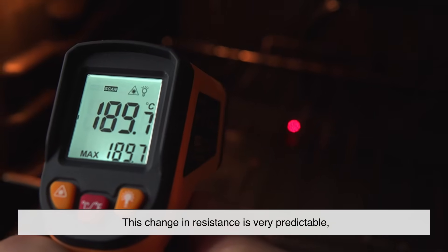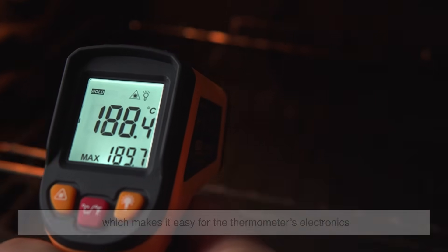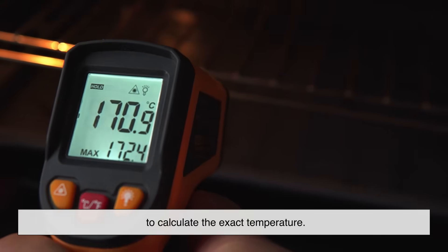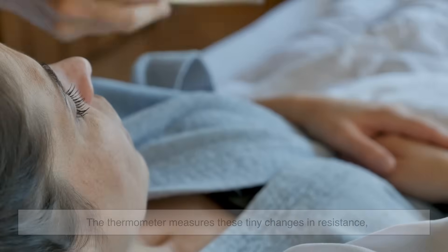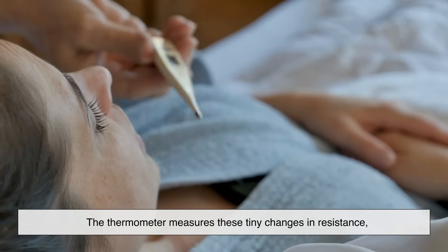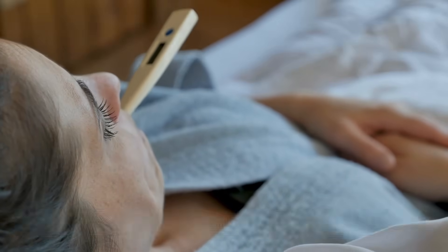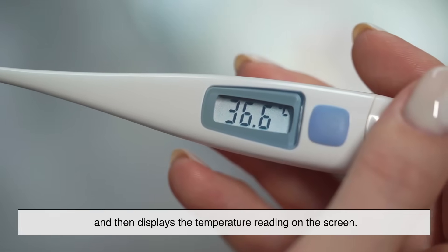This change in resistance is very predictable, which makes it easy for the thermometer's electronics to calculate the exact temperature. The thermometer measures these tiny changes in resistance, converts them into a digital signal, and then displays the temperature reading on the screen.